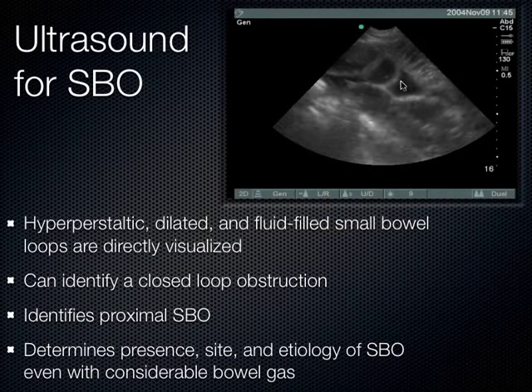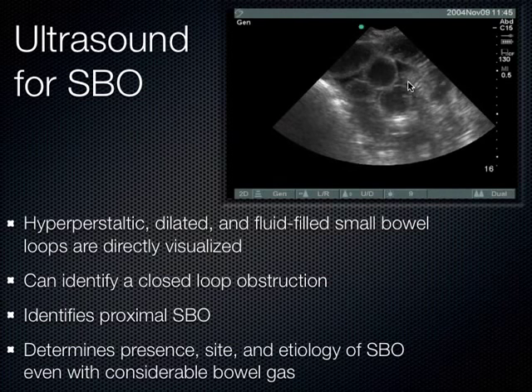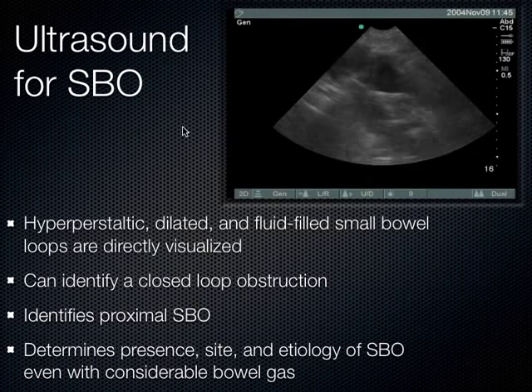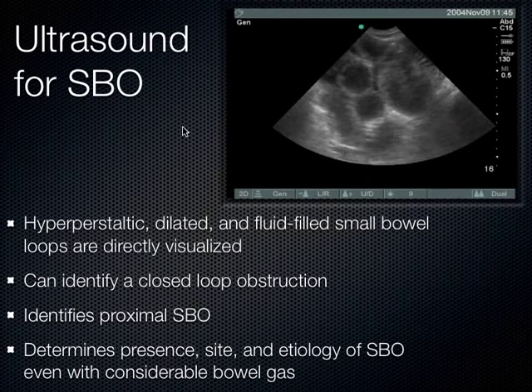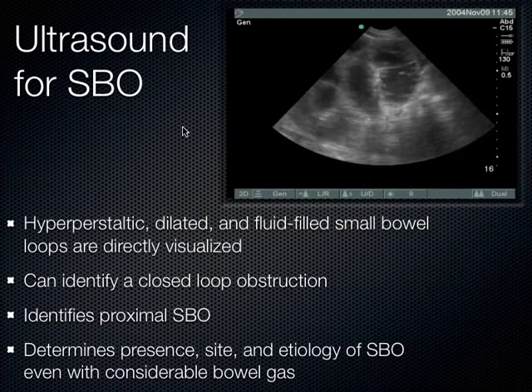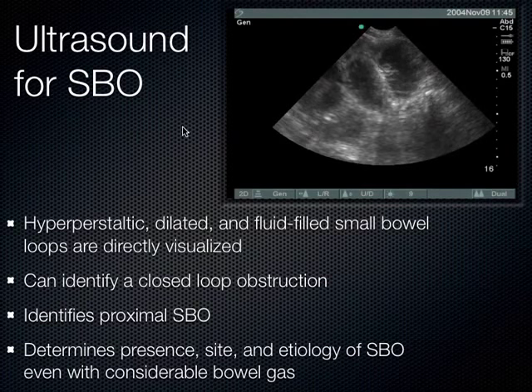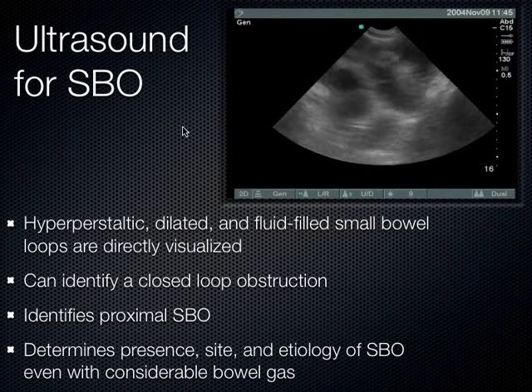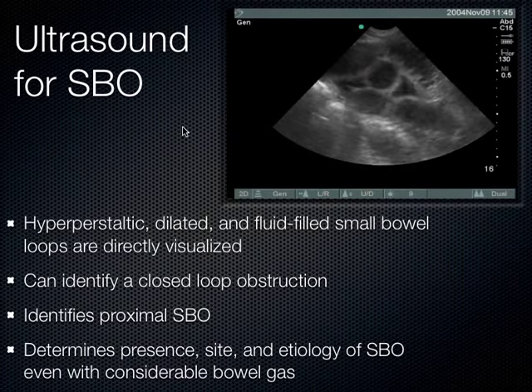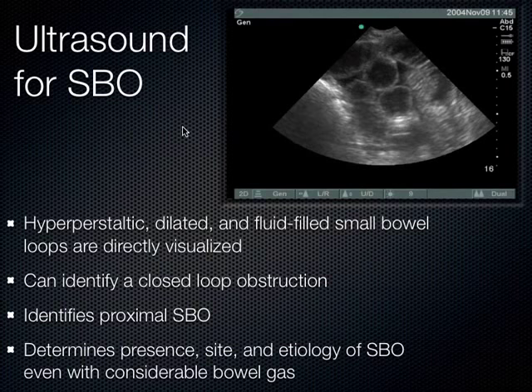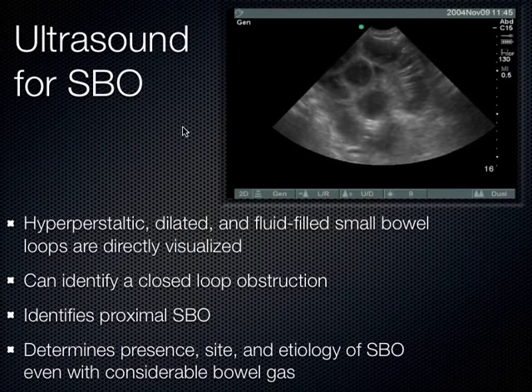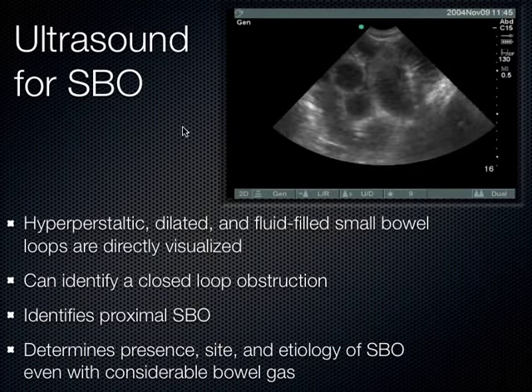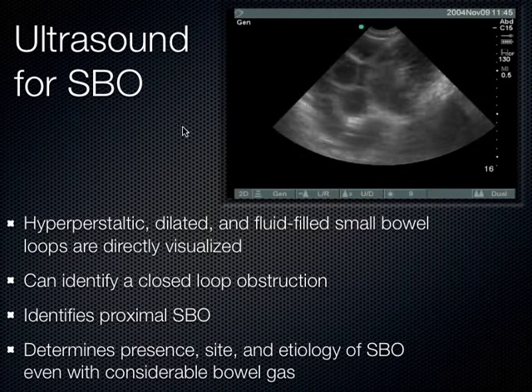Right there you see a little wedge of fluid. When the loops of bowel are layering on each other with fluid surrounding them, you see fluid between the loops that looks like a sharp angle. Sharp angles — free fluid wedging out between loops of bowel — portends a pretty bad prognosis, suggesting the patient probably has a perforation of their bowel. This is a surgical emergency.